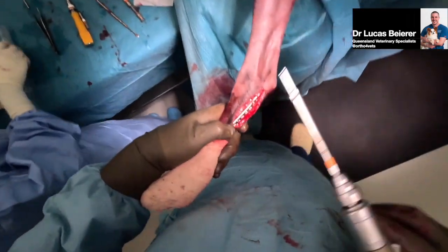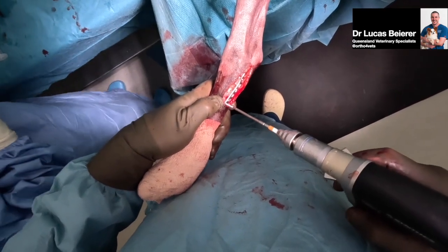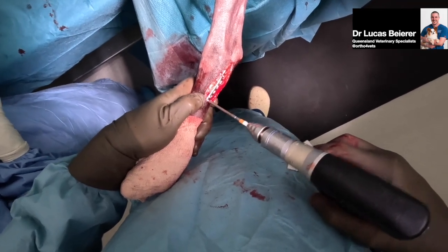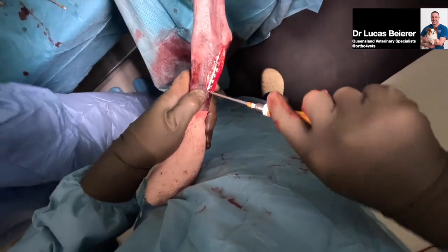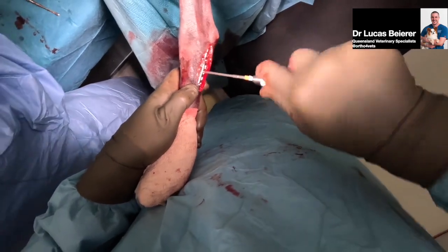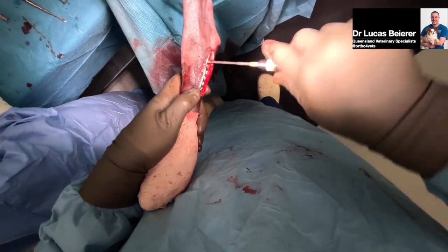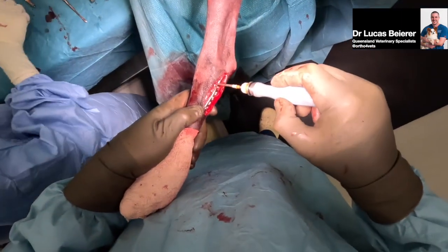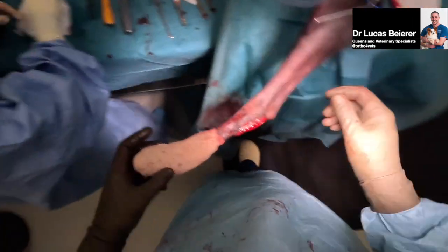Pretty stable fixation, so we'll close up at this point and get some post-op rads. Hopefully not have too much tension closing our soft tissues. And we'll just hand tighten these and make sure we're happy. The 2mm screwdriver. Cool.